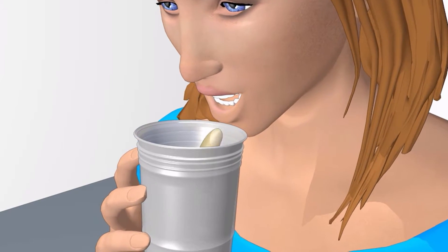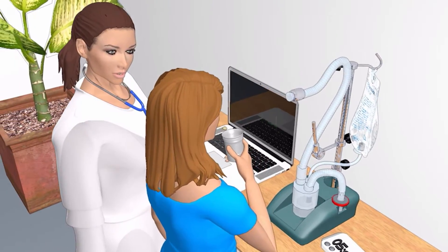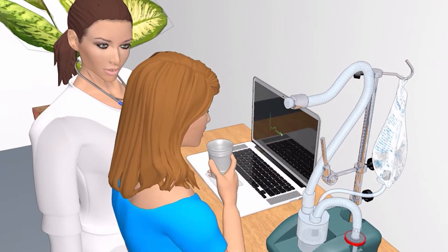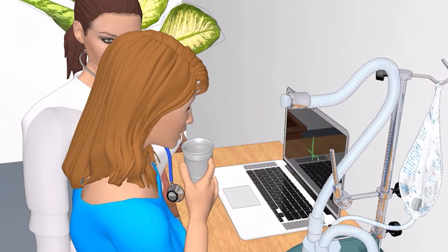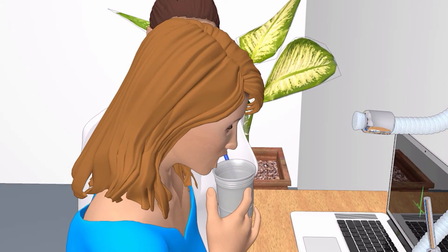This could take a few tries to be able to collect an adequate sample. Sputum induction can cause wheezing or shortness of breath, but the test will be monitored closely and it will be stopped if your breathing or lung function gets worse.